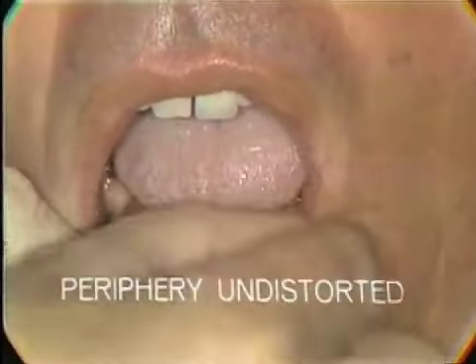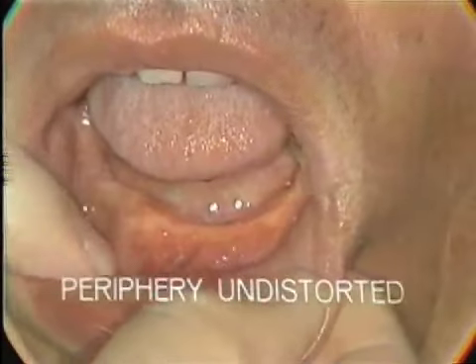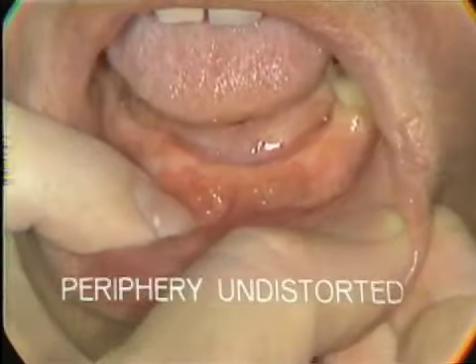In taking the impression, there is much controversy as to where the peripheral tissues should be. According to the principles that we're going to use, we try to capture those tissues at rest, or in the positions that they assume around function. As a patient functions in talking, speaking and eating, the tissues are more or less around a certain neutral area. If we look into the mouth, we see that the tongue probably functions near the occlusal surface of the teeth most of the time.